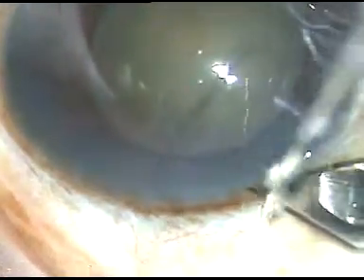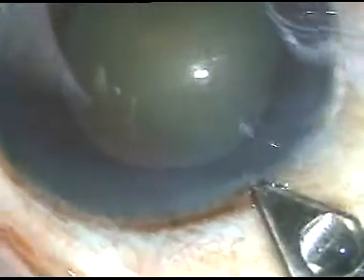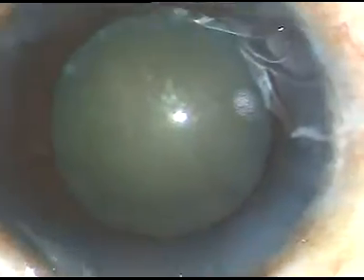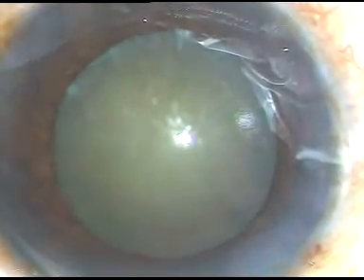Dear colleagues, this is Phaco surgery of a cataract with grade 3 nuclear sclerosis and mid-dilated pupil. In this case, I am going to demonstrate capsular Rhexis with Utrata forceps and direct chop.